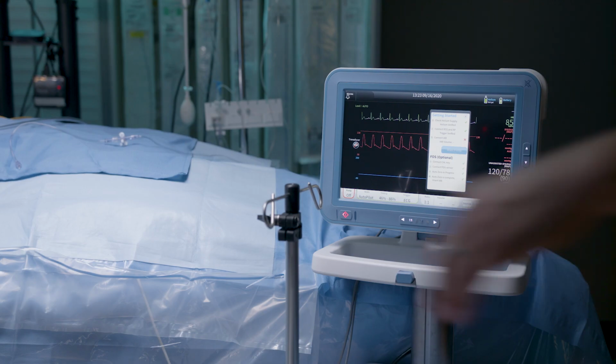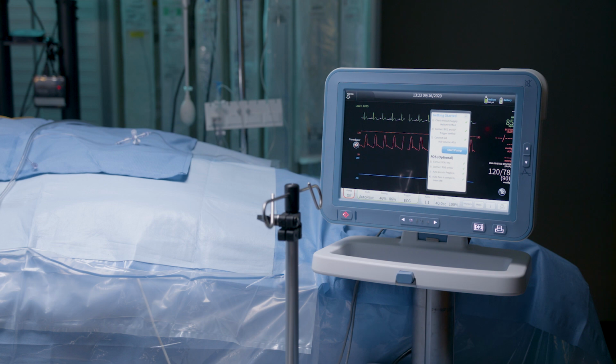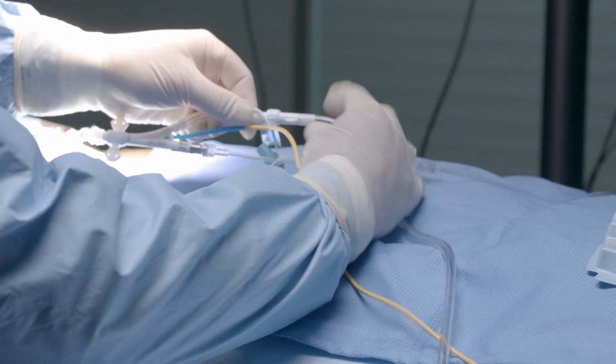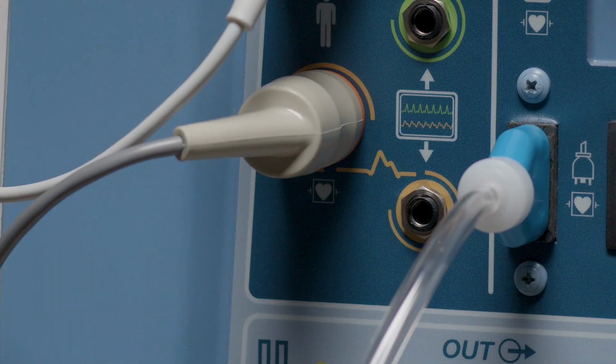The final connection will be the IAB gas drive tubing. The scrub person will hand off the IAB gas drive tubing to the circulating person to connect to the pump once the IAB has been inserted into the patient and its position has been verified. Connect the balloon connector to the pump. Verify that the IAB volume matches the connector.